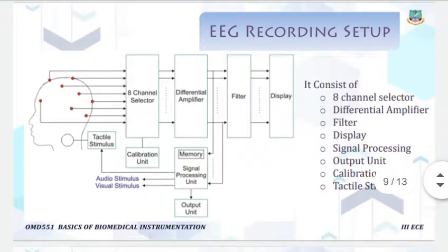Next, we are going to see in detail about the EEG recording setup. What does the EEG recording setup consist of?